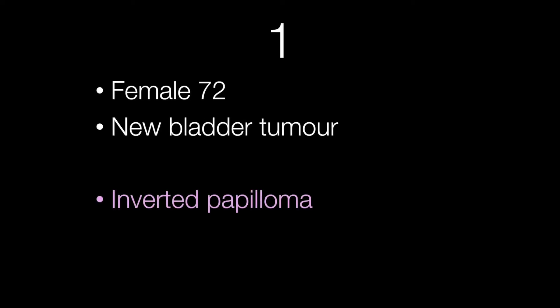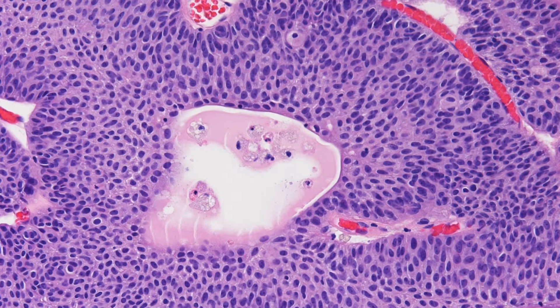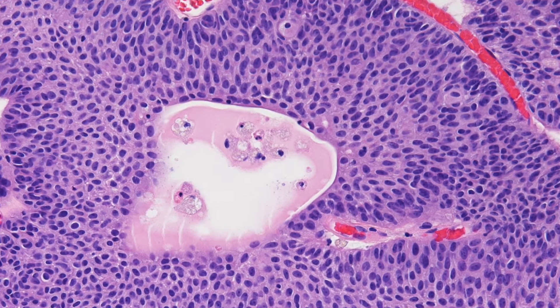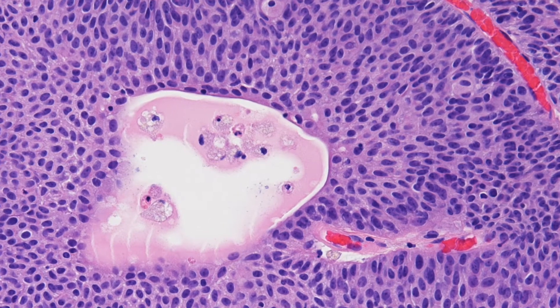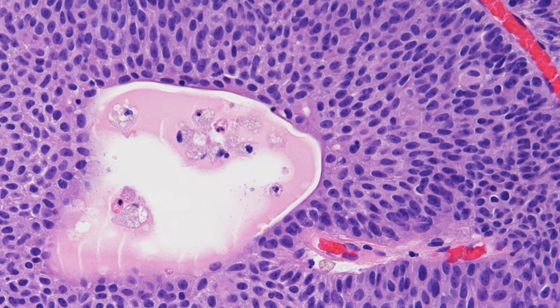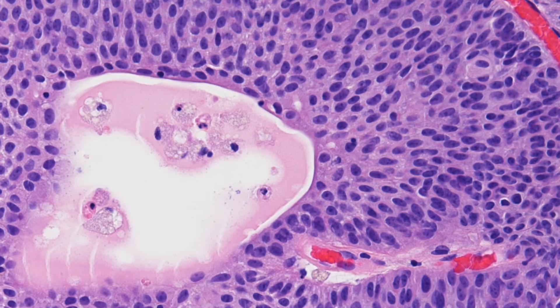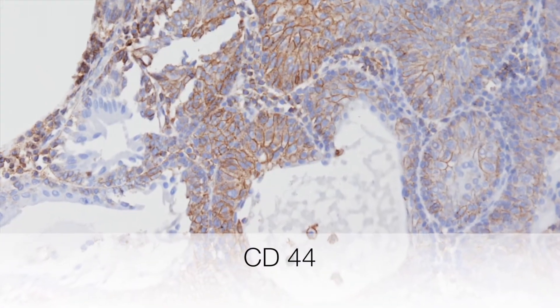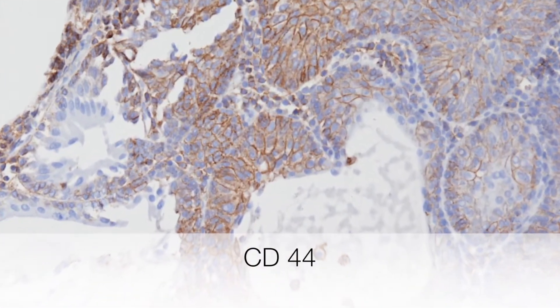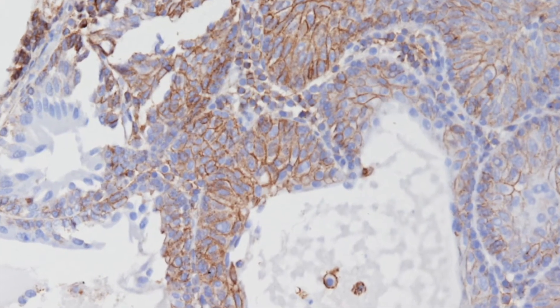This is the lesion from a female of 72 and the answer is of course an inverted papilloma. There is no evidence of nuclear atypia and the nests of urothelial cells are lined by umbrella cells. The CD44 shows characteristic full thickness staining indicative of a reactive type of urothelium.